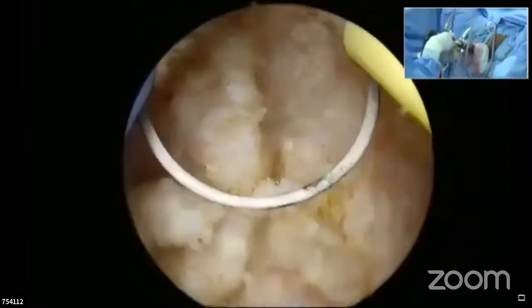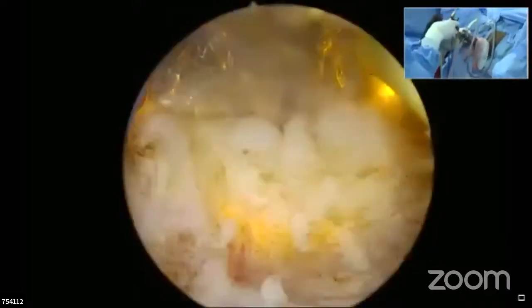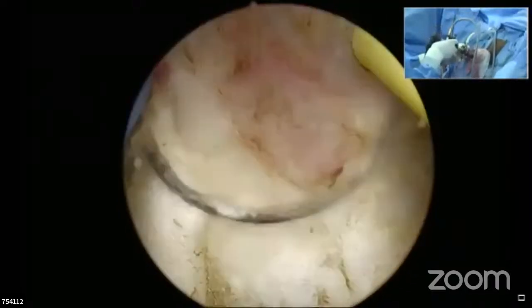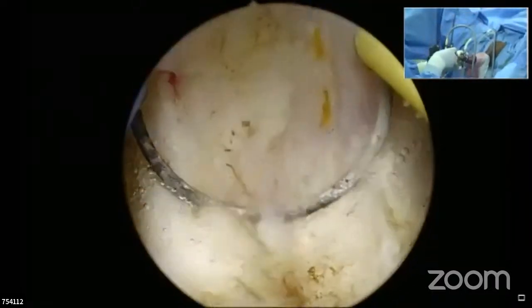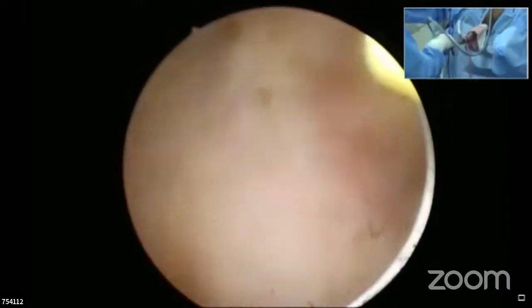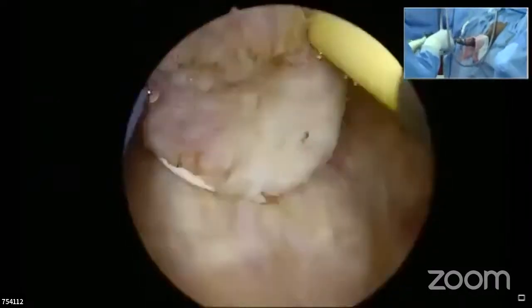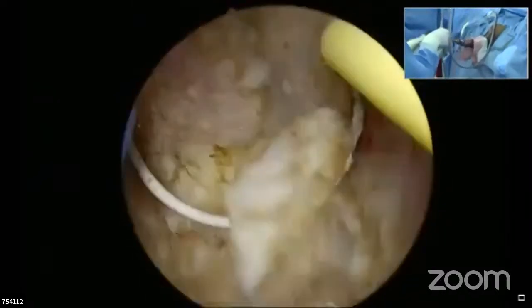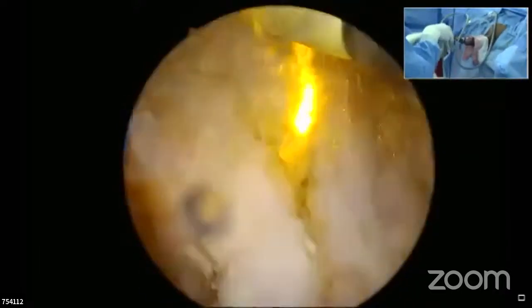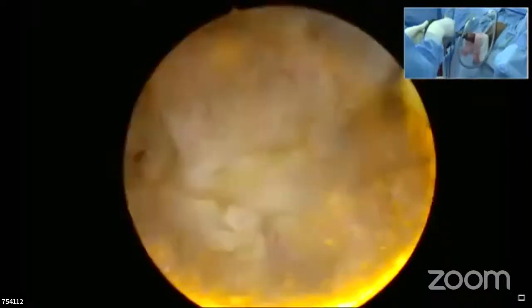See, Deepak, Mallikarjun is there? Yes, sir. What about robotic simple prostatectomy for a gland bigger than 150 or 200 grams? Why not do that? Save your urethra. You are so much concerned with the urethra. No, I don't deny that, sir, but that is our experience. We have done some cases, and we found post-operative irrigation.